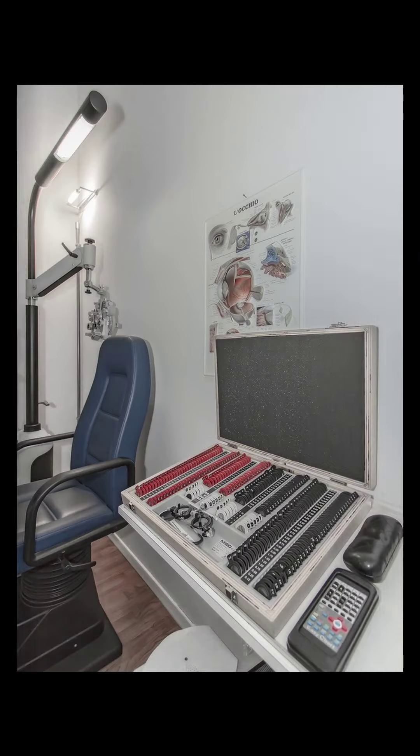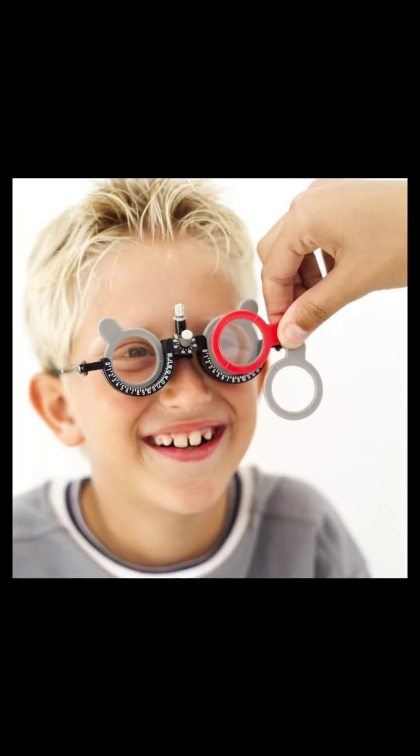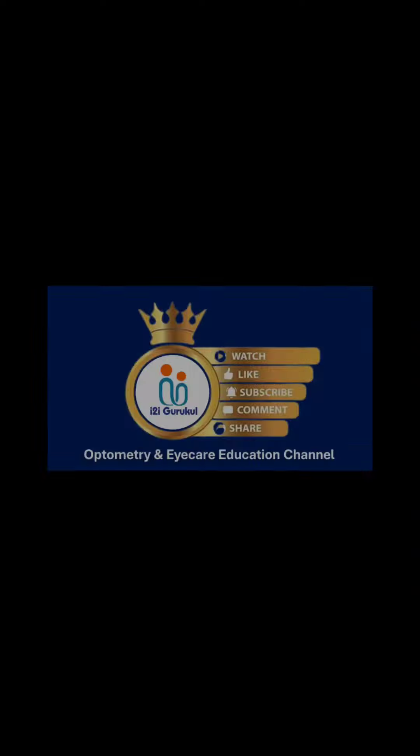These sets are essential tools in optometry and ophthalmology, enabling precise and accurate refraction and vision testing to determine the best corrective lenses for the patient.